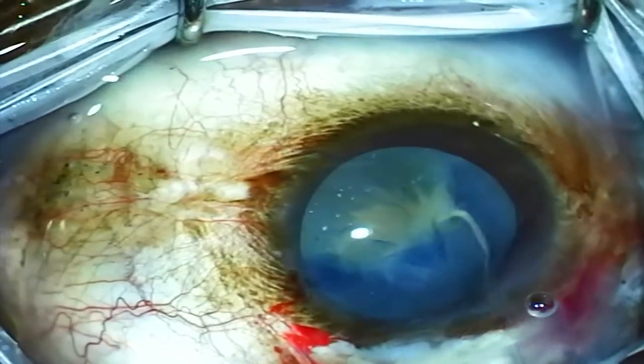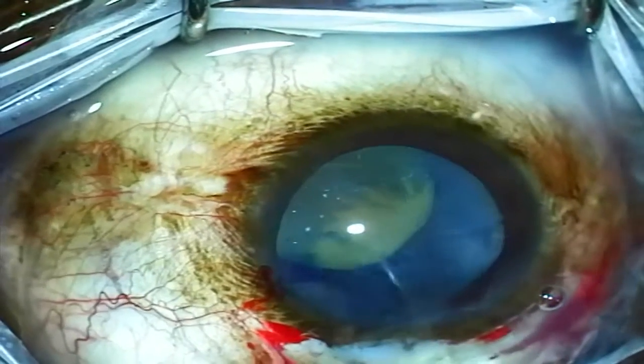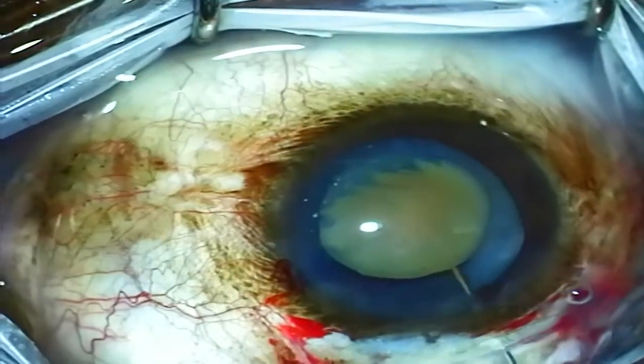I go in with a BSS cannula here and wash out all that lens milk. You can see that there's just a small lens nucleus left, and this is easily prolapsed into the anterior chamber.